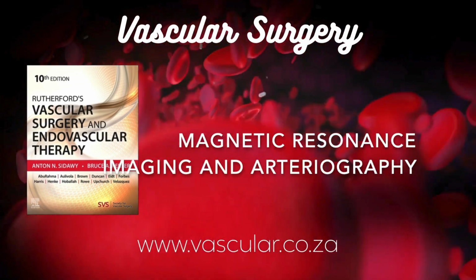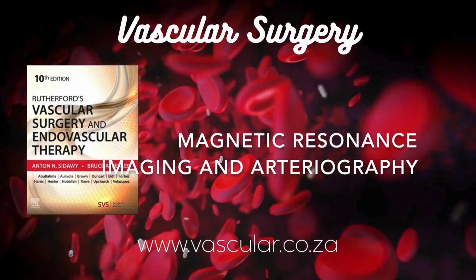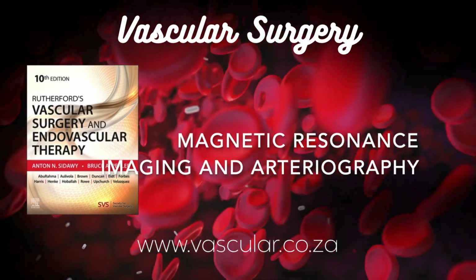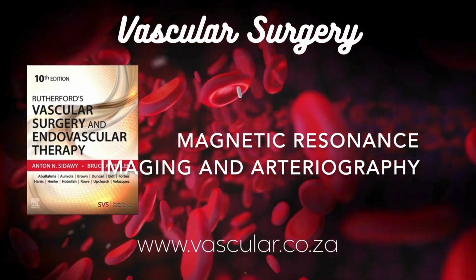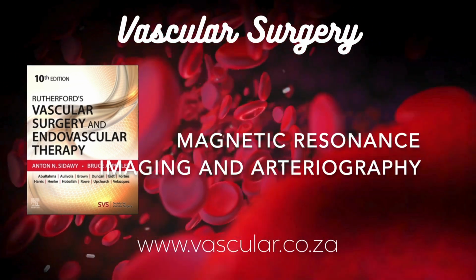And for treatments. Absolutely. Crucial for planning stent graft placement for aneurysms and then following up afterwards to check for problems like endoleaks, especially with the newer nitinol stents. Okay. Moving down a bit, what about the carotid arteries in the neck? Big role in stroke prevention, right?